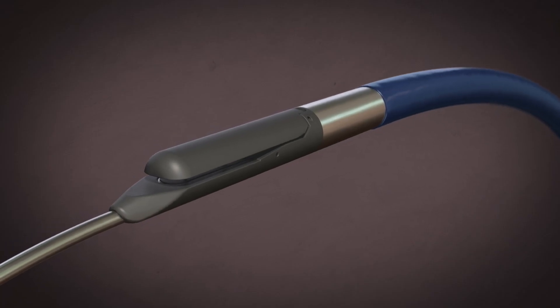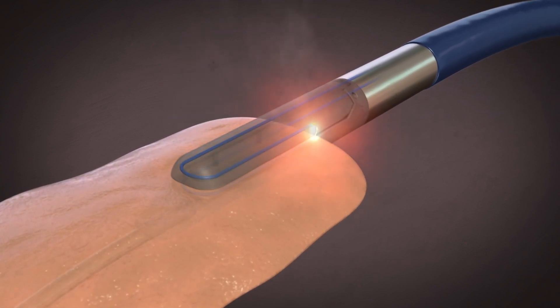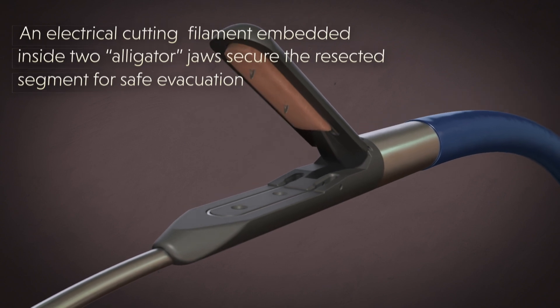The Splitter by HVT Medical enables easy cusp excision using a cutting filament embedded inside two alligator jaws. The jaws are equipped with two sharp prongs designed to secure the transected segment for safe evacuation.